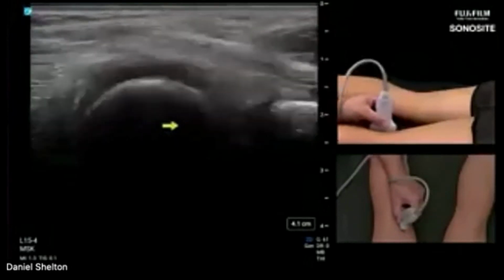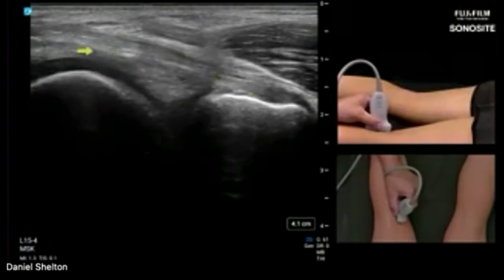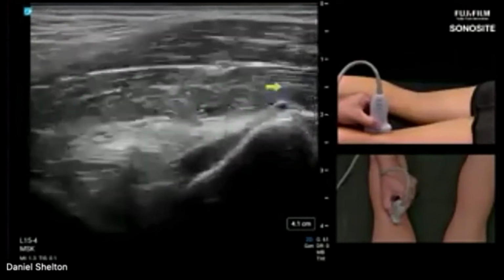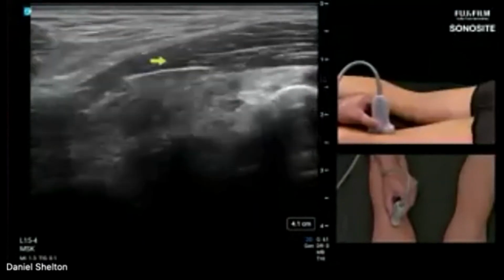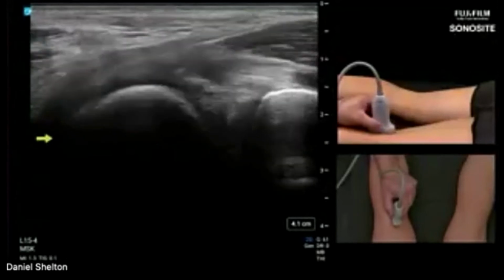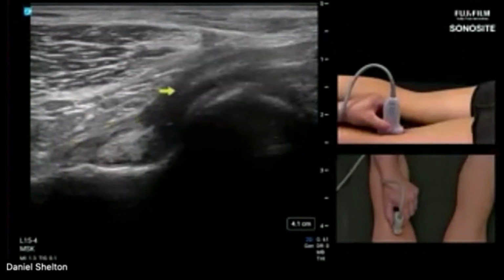If Baker cyst stuff is already kind of boring to you, go chase it more proximally up to the medial femoral condyle and see what you find. As I go more lateral to the semimembranosus, I'm going to keep bringing the transducer lateral. I see the medial head of the gastrocnemius, and that's the muscle there. This is all muscle, and the tendon was that really thin edge. As I approach more medial right there, it's diving and going to wrap itself around to the inside border of that proximal medial femoral condyle, out of view. Actually in view. Go Sonosite PX. I can chase that right here to its origin. So here's the origin of the medial head of the gastroc.